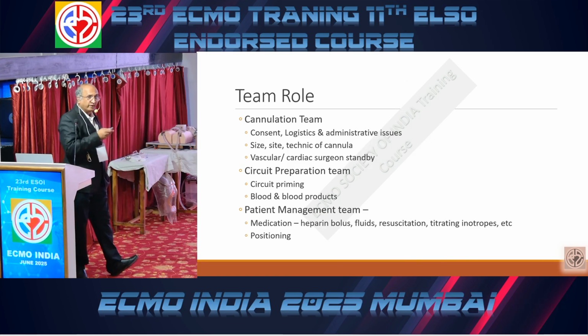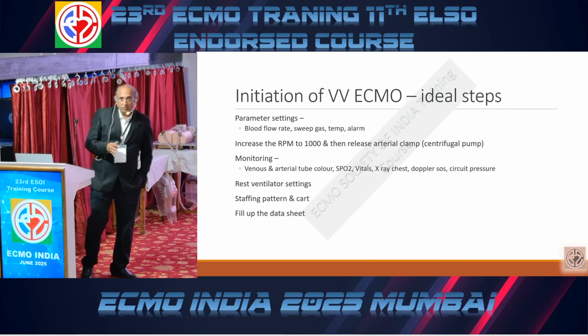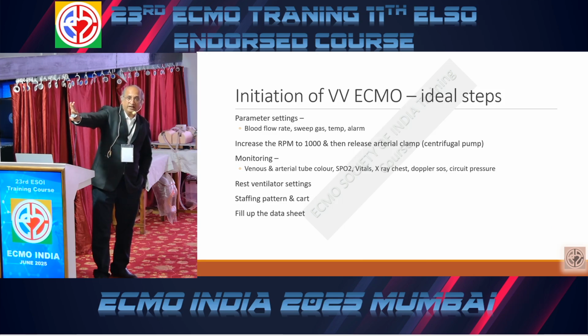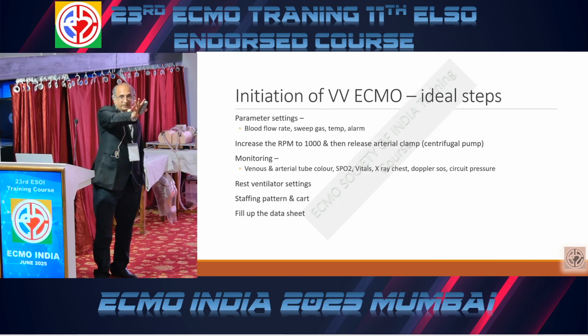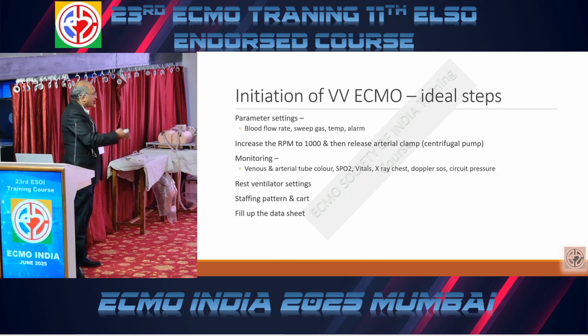So the team has to be divided into 3 parts. And that is what we are intending to do over here in the next 3 days. We want you to develop that team spirit, that you divide your team into 3 parts at the time of initiation, and at the time of management, divide your team into 2 parts. One will manage the patient, one will manage the circuit. So that is what we want you to learn in the next 3 days. Ideal steps I told you.